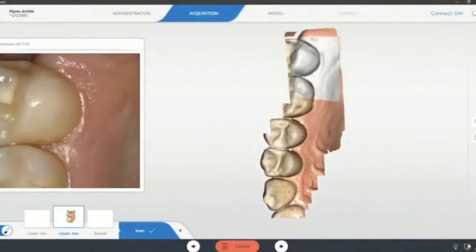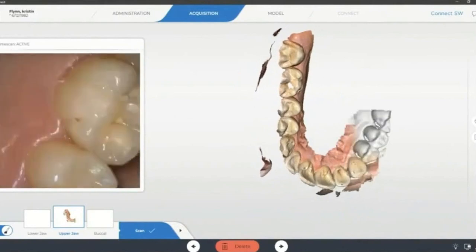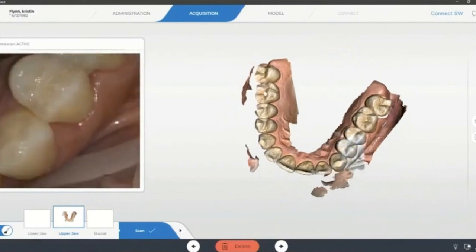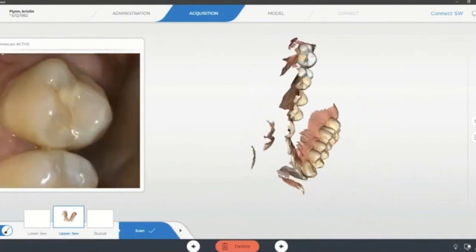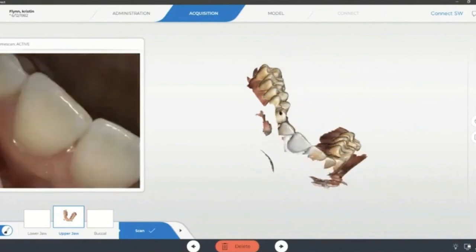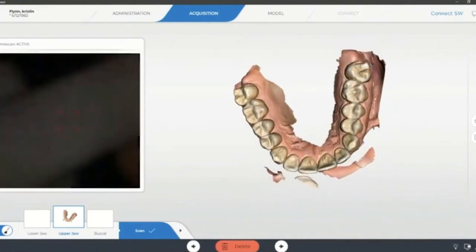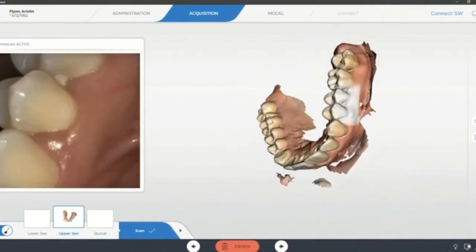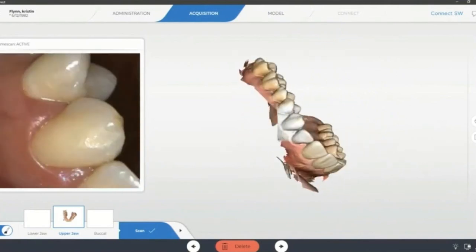Scanning a model and scanning a mouth is supposed to be the same, no difference, same speed, same everything. With today's scanners, again, the capture of the data is pretty fast. I use Primescan, and the Primescan is great. It allows me to have a full scan of an arch in 2.5 minutes. And when I say 2.5 minutes, I mean a very good impression with great data. You can scan faster than that, but I know that sometimes we are missing information. So 2.5 minutes is a good time that I always give myself to have a good impression.